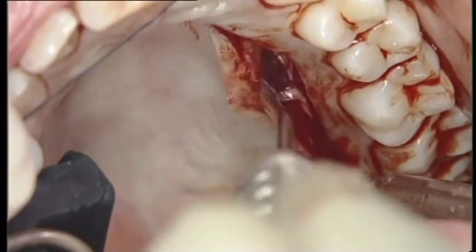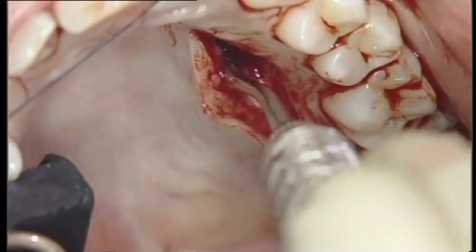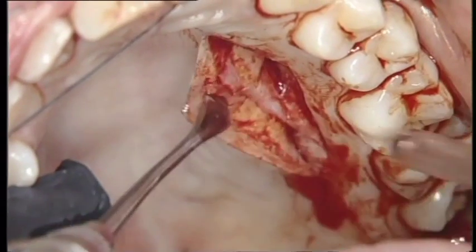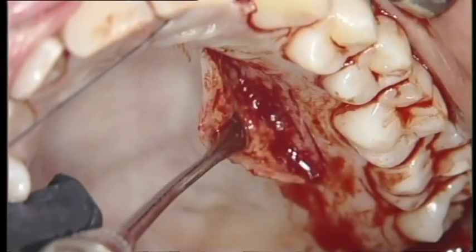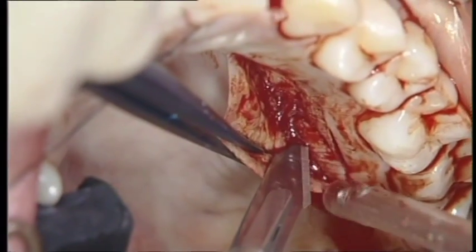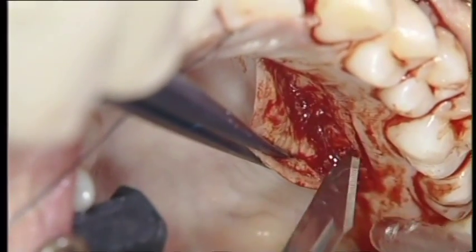The connective tissue is then detached from the bone surface using the paddle-shaped end of the PP Boozer instrument. The attached portion of the graft is incised at the distal, medial, and mesial borders. After this incision, the connective tissue graft can be easily harvested from the donor site.